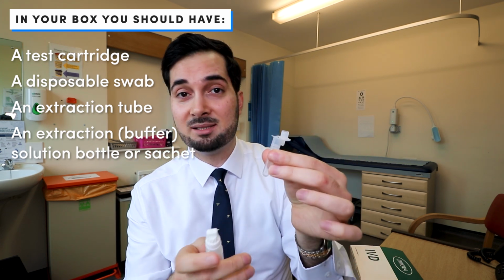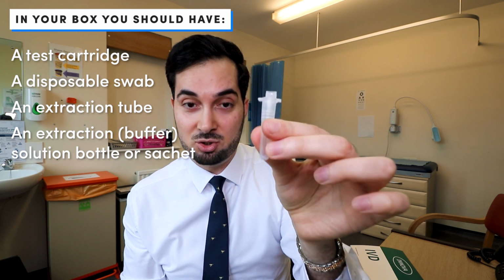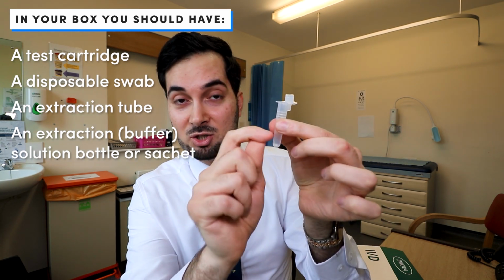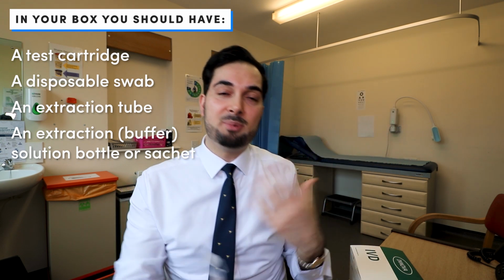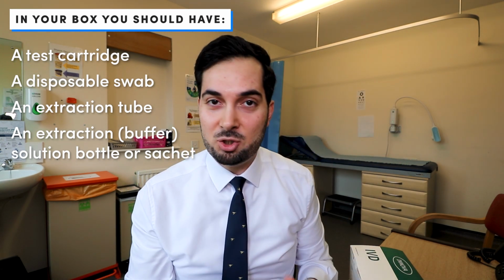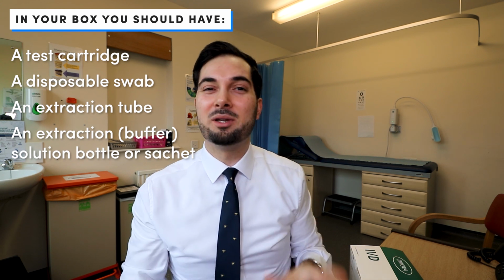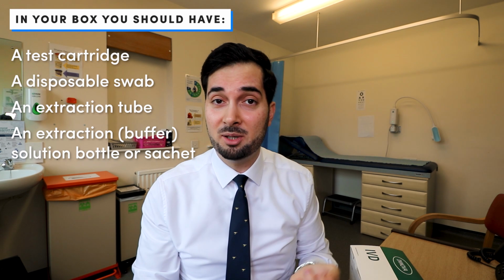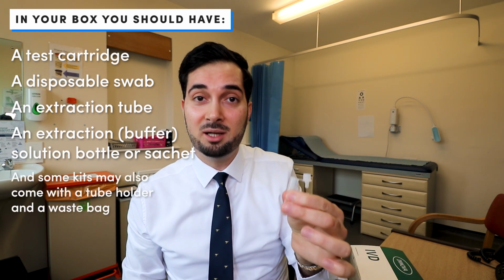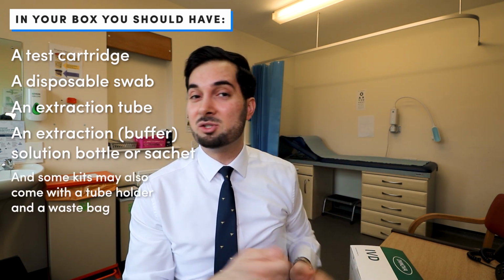And I've also seen test kits that come as just an extraction tube, and it's got the actual extraction solution in there, and it's sealed on the top, and you open it. So just be aware of that. There will be slight variations in the test kit that you're using, but overall they're doing the same thing. Some test kits also come with a tissue paper, they come with an extraction tube holder, but the IVD one doesn't, so just be aware of that.